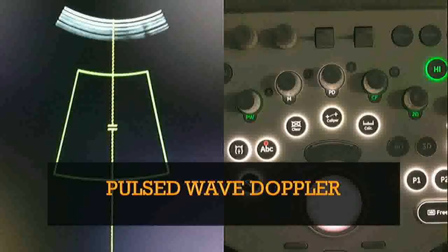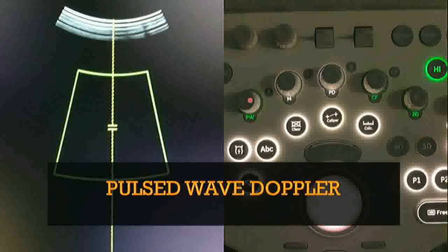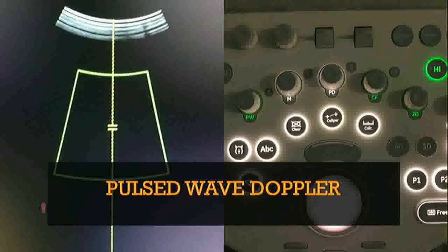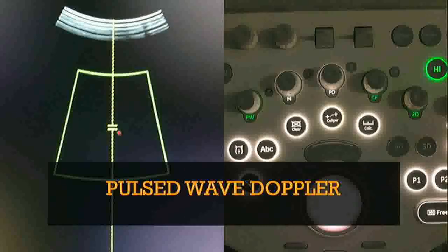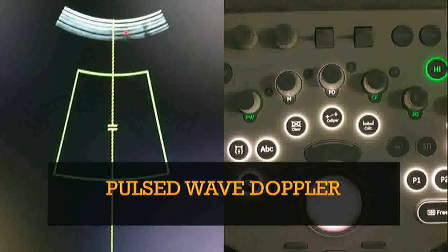Coming to pulse wave Doppler, which is the most commonly used in obstetric practice. On the keyboard you can see the PW button. When you click this button, a line will appear on screen — this is the line of insonation. There is a small gate in between. Always remember: this line of insonation denotes the direction of the ultrasound rays going into that particular place on the screen.